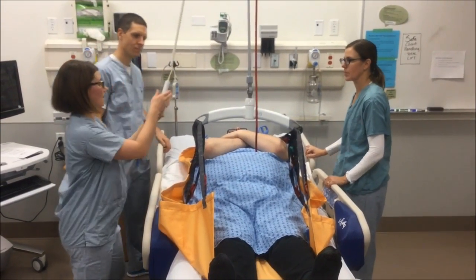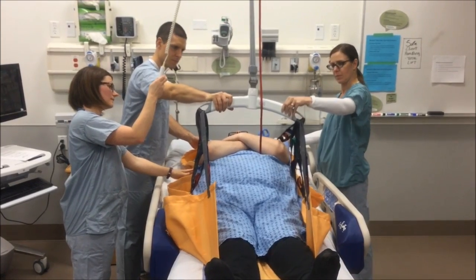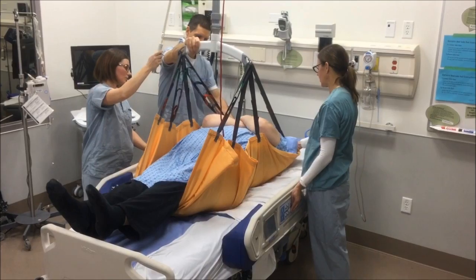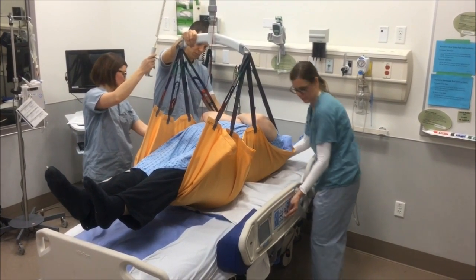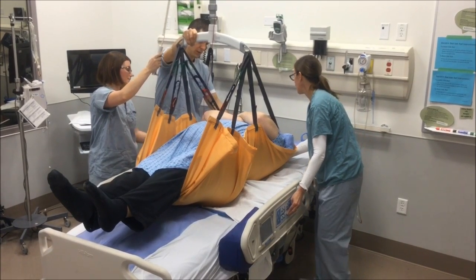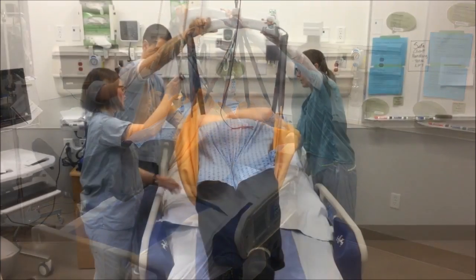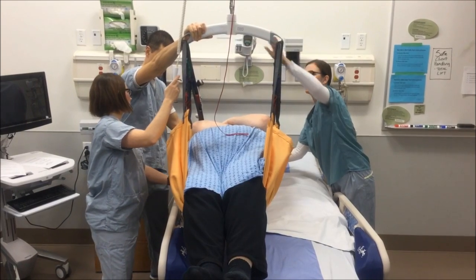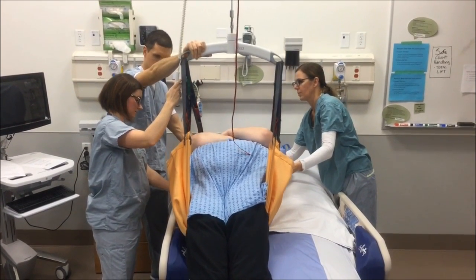Talk with the client to prepare them for repositioning and advise them to keep their arms within the sling and, if able, to cross their arms on their chest. Raise the bed rails on the side that the client is moving toward. Apply tension to the sling and verify that it is supporting the client and that the client is comfortable and not being pinched, and that the sling attachments are secure. Raise the client above the bed just enough to clear the surface to reposition safely. Lower the bed at the same time so that the client is not raised any higher than necessary.